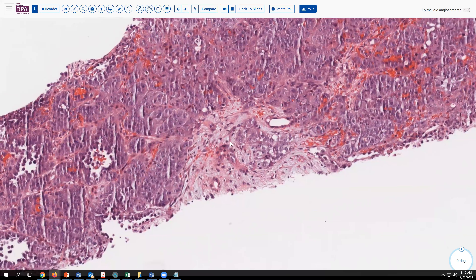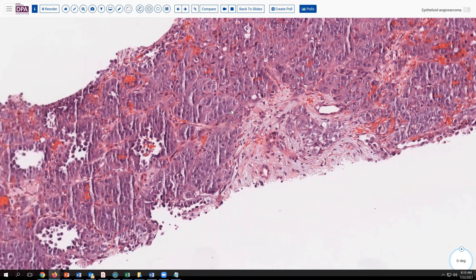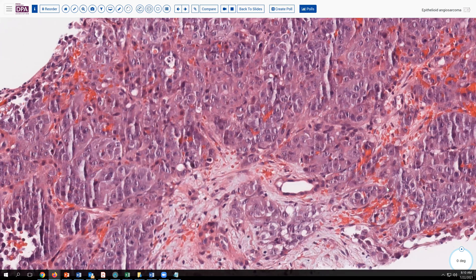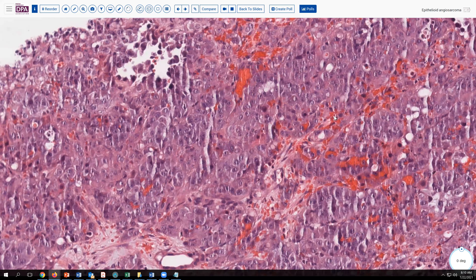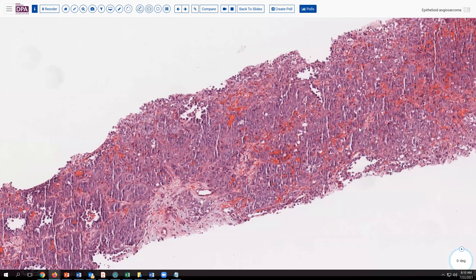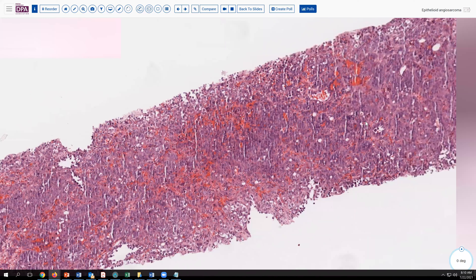Looking at these cells, they have quite an epithelioid appearance and a malignant appearance. These nuclei are large, and we have macronucleoli. Again, we have quite a bit of intervening blood extravasation — hemorrhage surrounding these nests as well. So we might wonder about epithelial neoplasms.